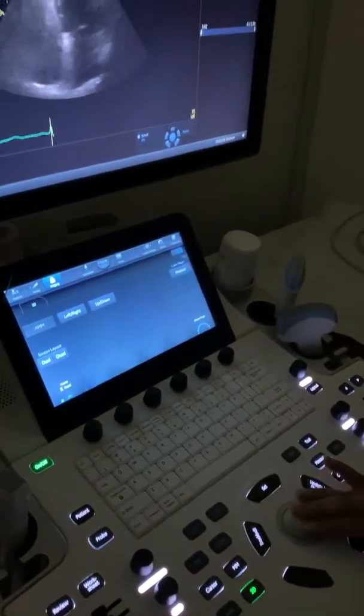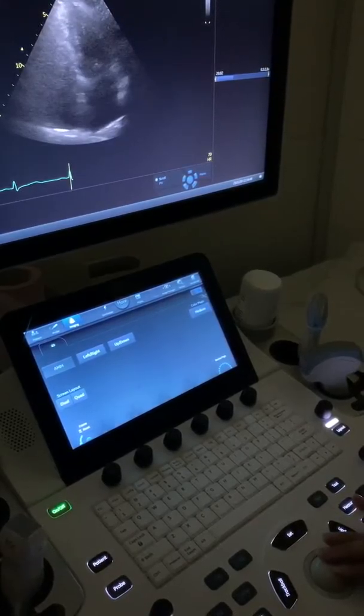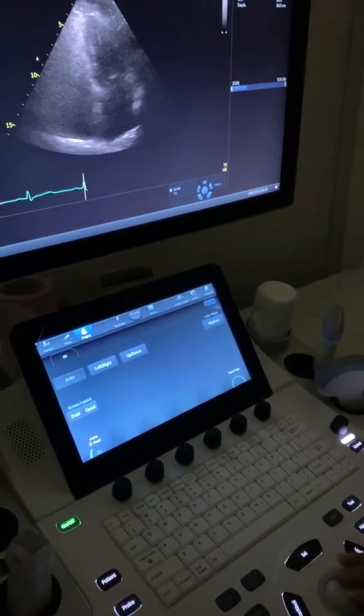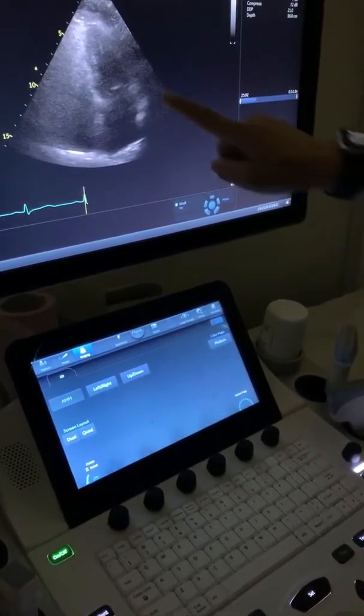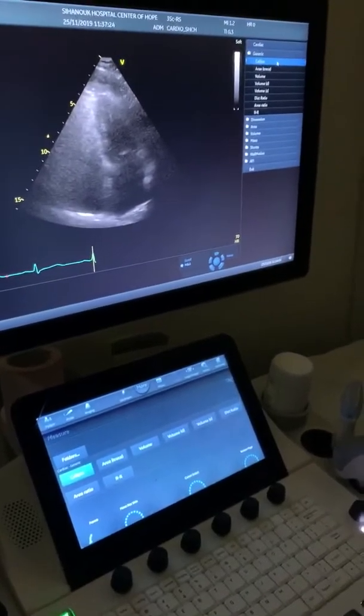Okay, this one is closed, right? So here, before it opens. Okay. So, I go here. That's where I'm going to start measuring my left atrium. So you go by measure.